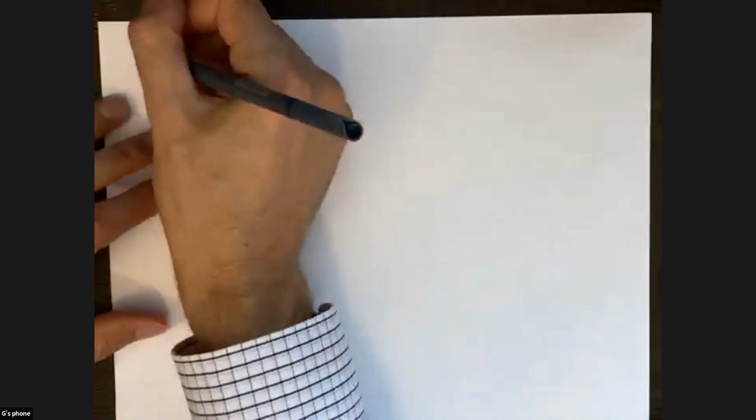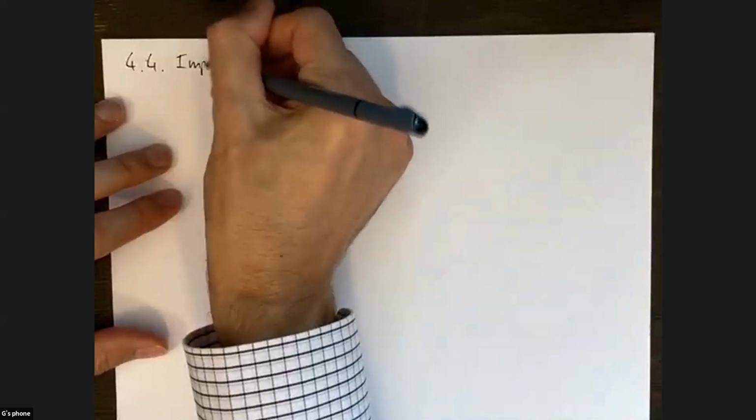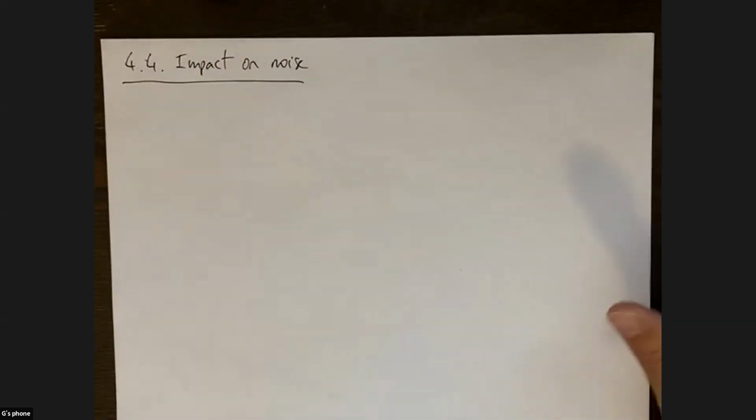Yeah, good point, Craig. So we're going to talk about the impact on noise. If you go to the lecture notes, there are more details about noise and the type of noise that's present in PET images. The dominant type of noise in PET and SPECT images is called Poisson noise. You can read the lecture notes if you're interested. This is not going to be on the homework or anything, but it's there if you want to go deeper on that topic.